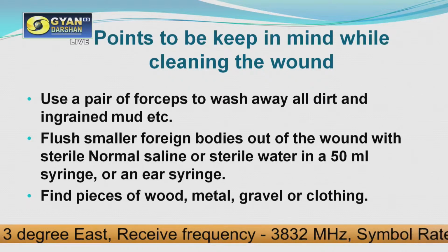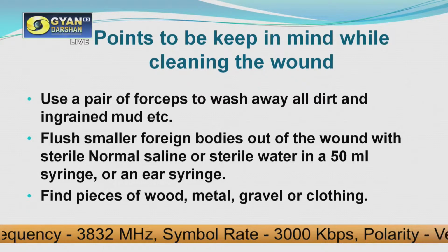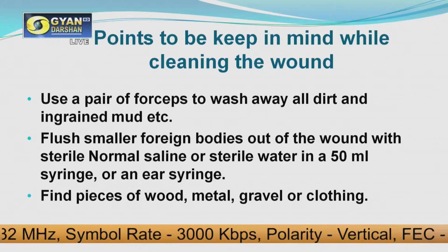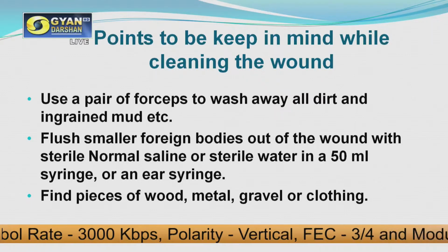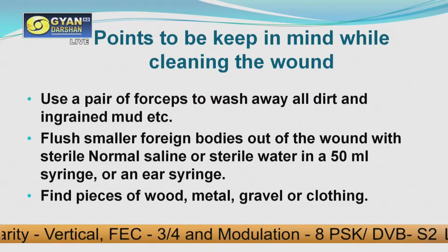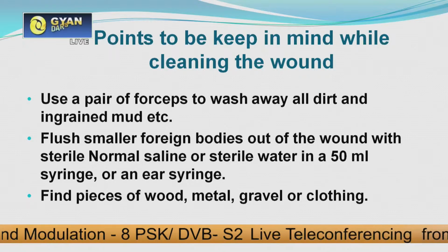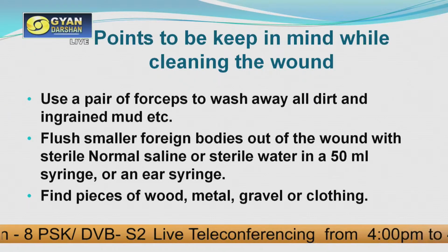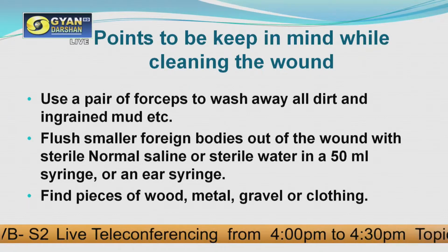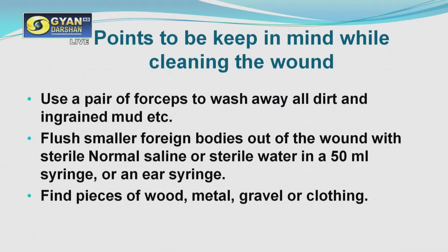Sometimes a leftover bottle of normal saline is lying around and you see that it is normal saline, but it was punctured, it was used before, maybe it is contaminated. So you have to take care when you are using normal saline to clean, because it is a surgical dressing, you have to avoid infection. So be conscious in taking only sterile normal saline or sterile water.